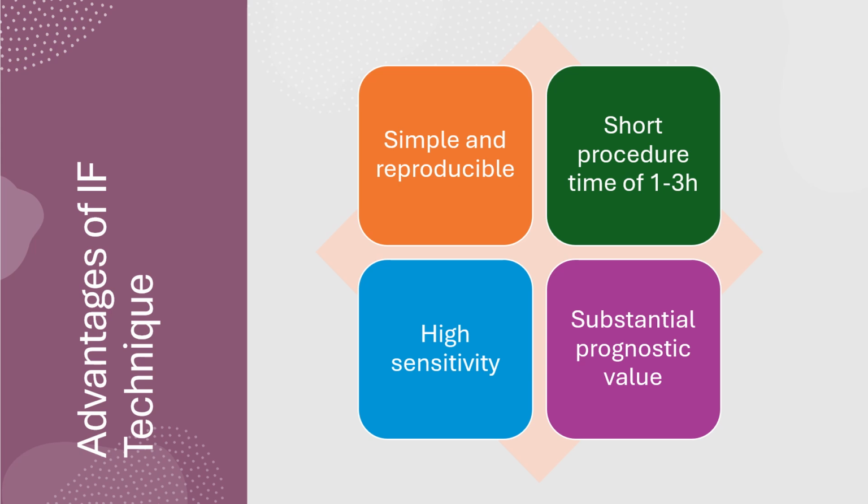Advantages of the immunofluorescence technique. The immunofluorescence technique is simple and reproducible. It is a short procedure which can be completed within a time period of 1 to 3 hours. It shows high sensitivity and it has substantial prognostic value.